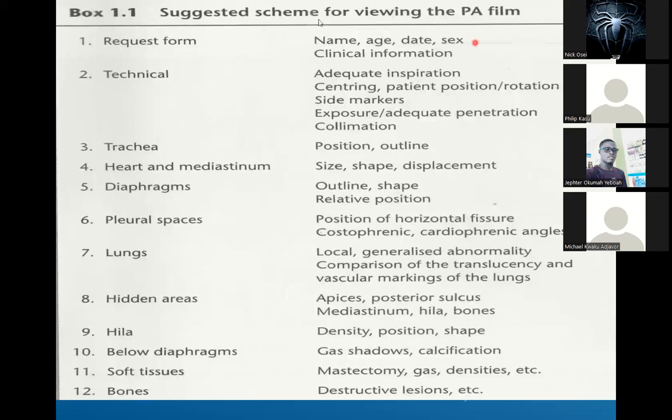Okay, so you look out for the name, the age, the sex. Well, you know, you could take an X-ray and it belongs to someone else, and you give the person some wild diagnosis and give someone a heart attack for no reason. So you have to be able to confirm that the X-ray you're holding is for the person that you intend it to be.